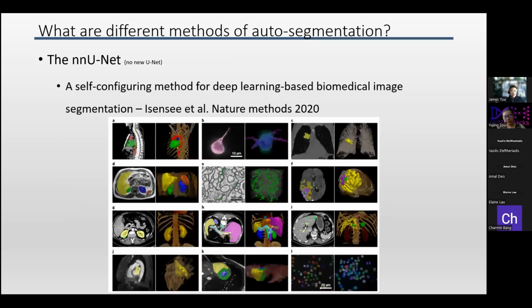The other deep learning implementation, the nnUNet, proposed in 2018. This paper was written in 2020. It's short for no new UNet. The idea is that UNet is a very, very powerful, large capacity neural net that's able to do quite a lot of the work. In recent years, a lot of people have been looking at different ways of proposing different auto segmentation, deep learning implementations and algorithms and models. Each one of them a little bit more powerful, more capacity, more complex. But the reality is you probably don't need all of that. What you really need to do is to do the pre-processing properly and the post-processing properly. The pre and post-processing and also the choice of your parameters and hyperparameters, it's an art in itself. But there is a systematic way that you could approach that to really get it done properly.